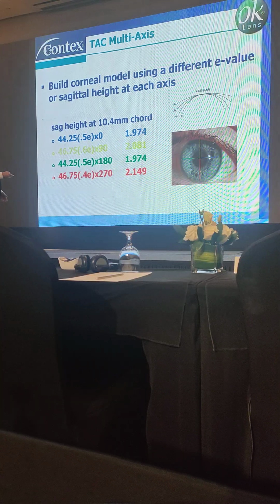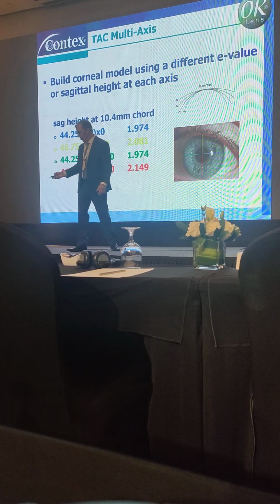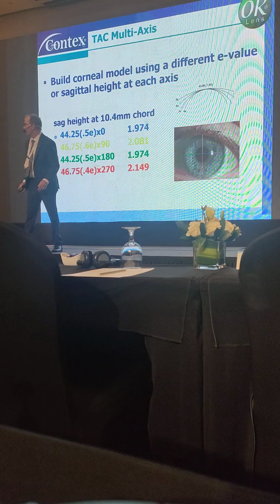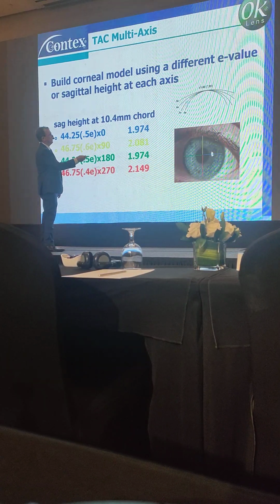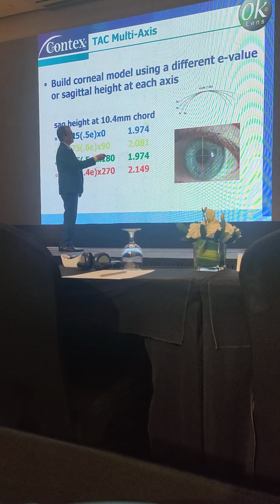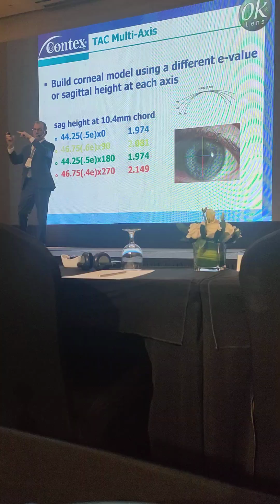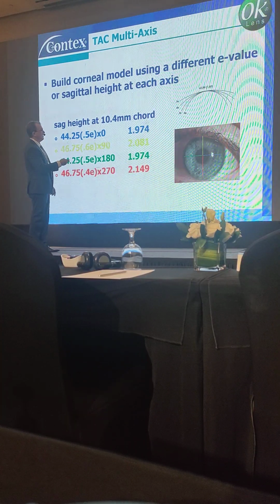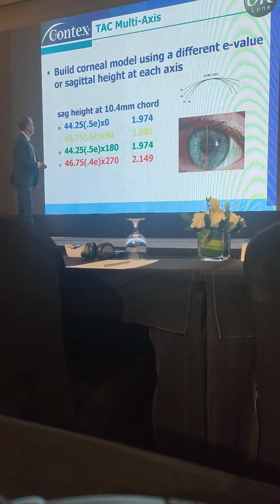This is kind of what Oliver was showing earlier. Remember when he showed this drawing? I think he wiped it out. But he was showing the drawing to show E value. And you can see the 0 eccentricity is a sphere, like a ball, a circle, right? 0.3 is a little more elliptical, 0.6, 0.9 is very elliptical, right?